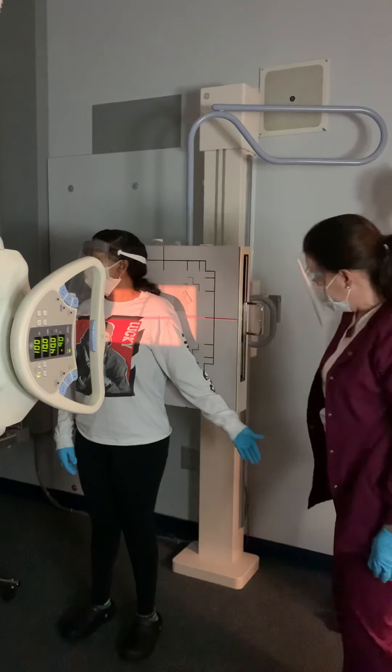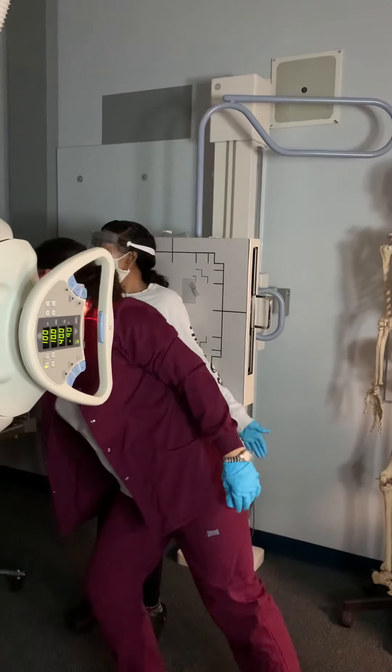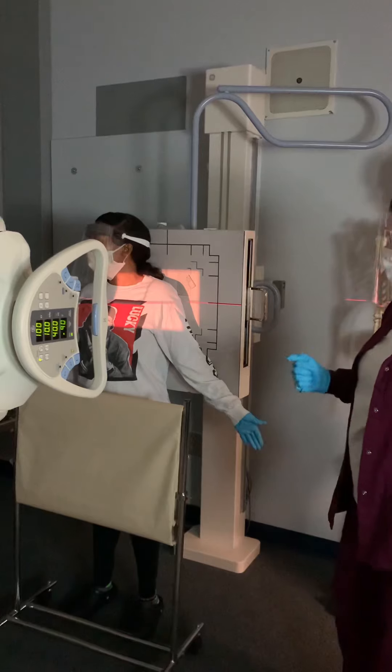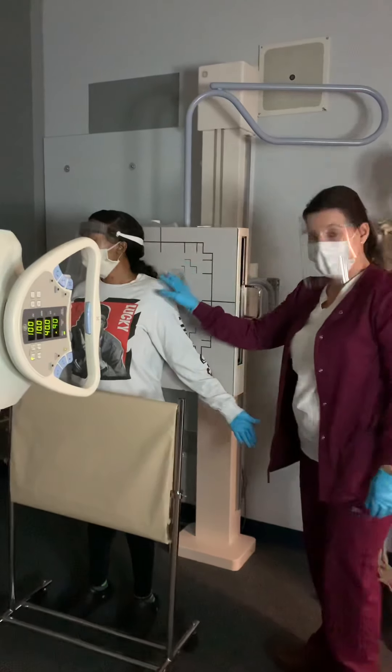I'm going to get my patient to hold her breath. Hold your breath, don't breathe, don't move. Beep. You can breathe and relax. So that is external rotation.